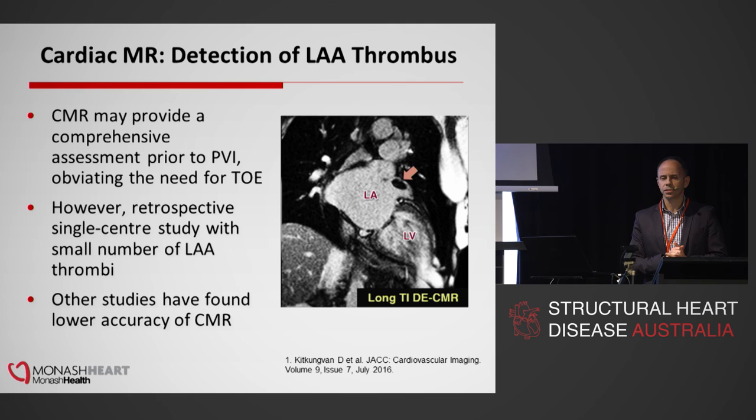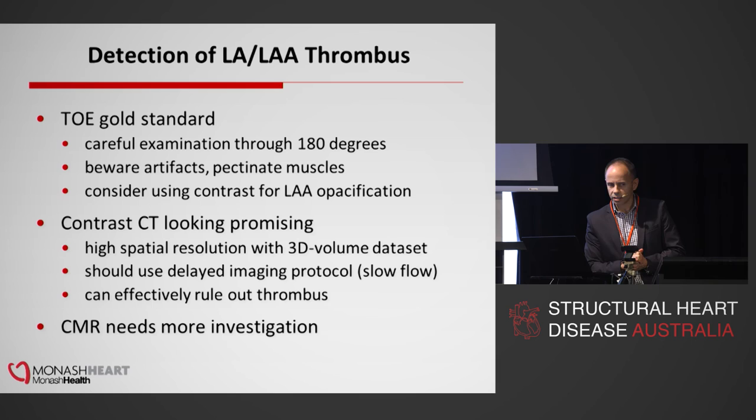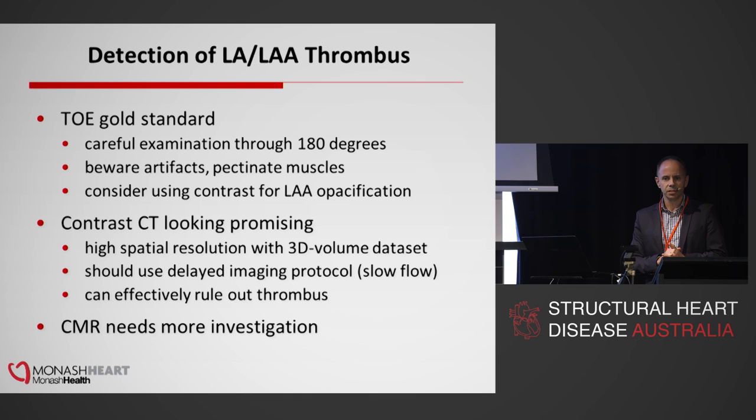So to summarise, TOE remains the gold standard, but it does require a fairly careful examination and some expertise and experience from the operator, and judicious use of contrast as well. CT contrast with delayed imaging looks very, very promising. And I think you can effectively rule out thrombus if you have got effective penetration into the appendage, and CMR needs further evaluation. Thanks for your attention.